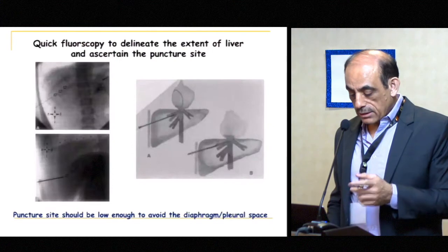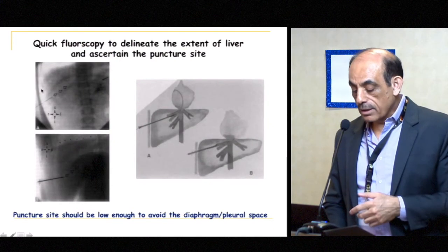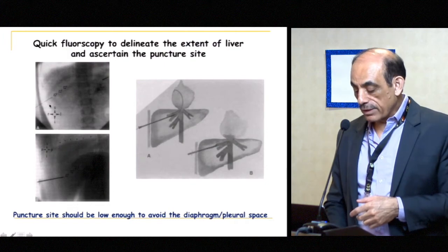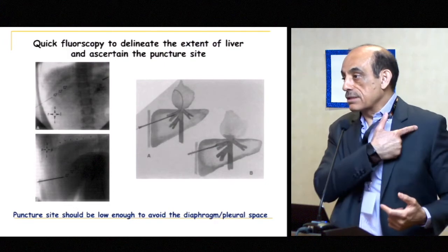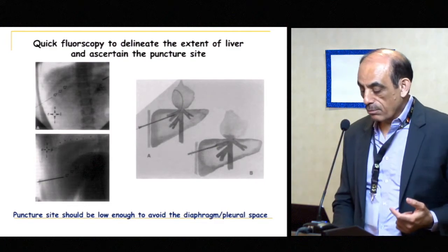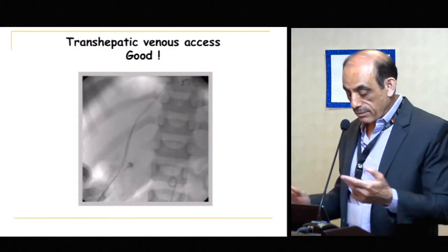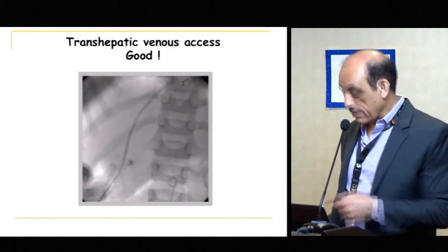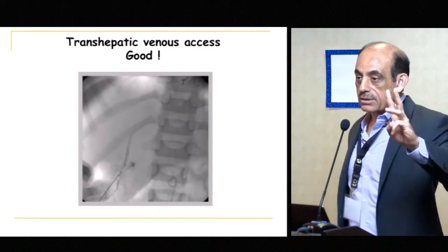Okay, so I'll tell you. What you're going to do is you're going to go to the middle, do a quick fluoro, go in the middle of it and mid to anterior axillary line and point towards the shoulder. Okay, point towards the shoulder. So when you're getting there, for example, this is one of my cases, very small vein, but I was able to do that. Once you're there and you start injecting, there are three scenarios that can happen.